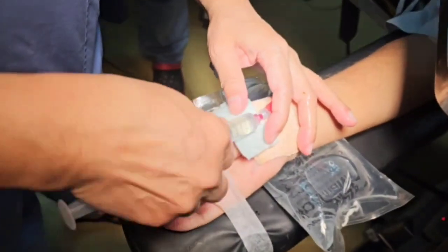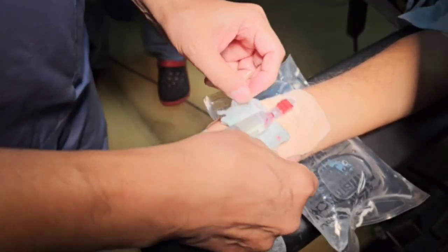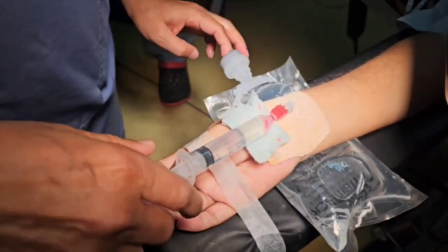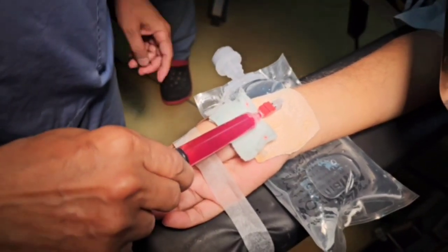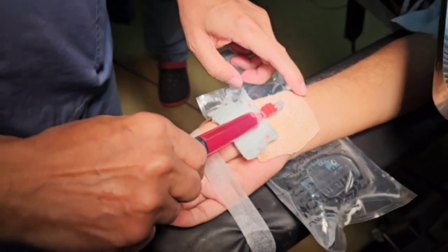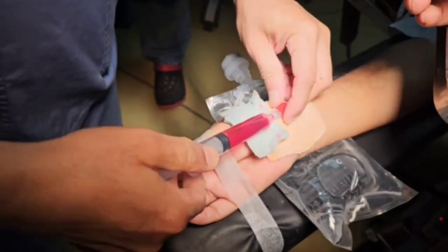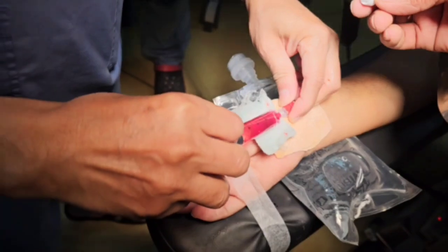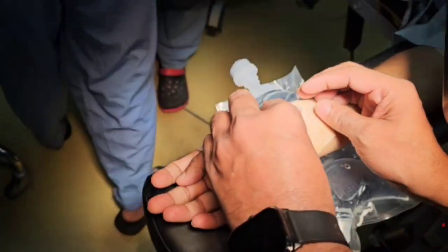It's important to regularly flush the arterial line with heparinized solution. As we know, arterial blood is more sticky and it can cause overdamping of the arterial waveform in the monitor by forming micro blood clots. And that's all for today.